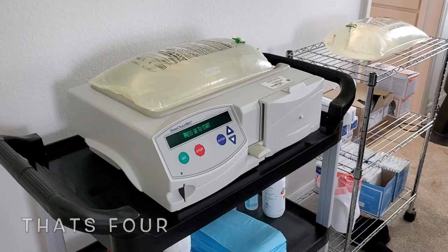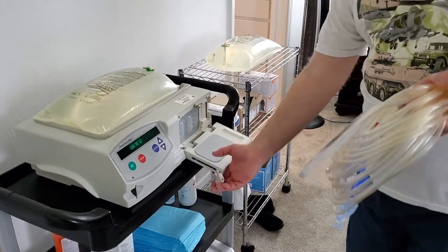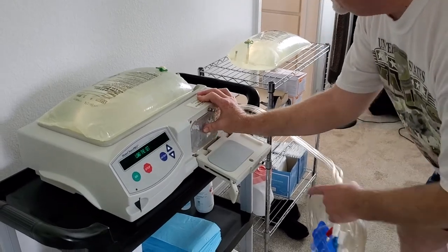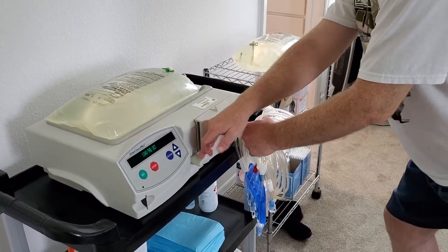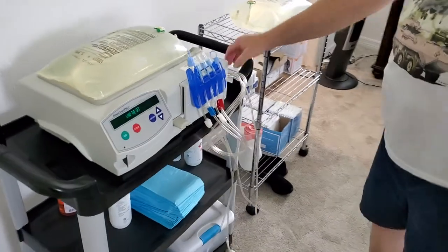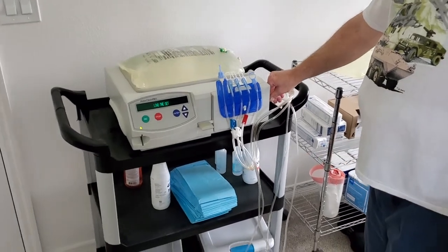It says press go to start. I want to grab my cassette — I'm going to hit go and you'll hear it kick up, and it's going to say load the set. I open this up and just slide it right in. When I close it, I want to make sure I keep the lines straight for where they're coming out of that hole — if it's crimped, the machine's going to let you know. Sometimes as it's trying to prime or run a self-test it'll give you an error, and you usually just need to jiggle the lines to straighten them out.